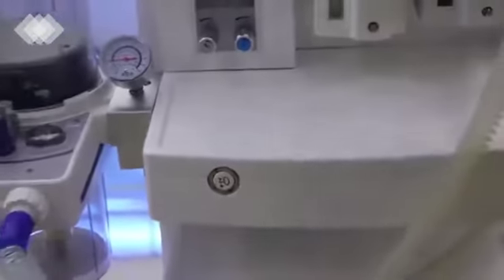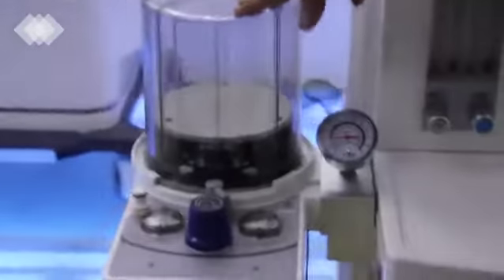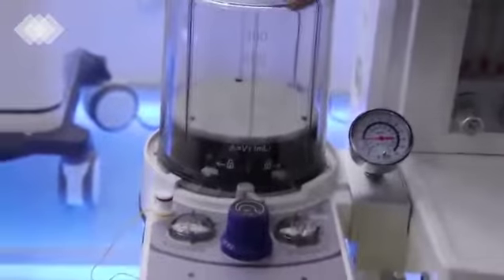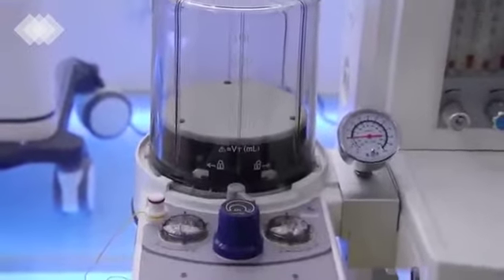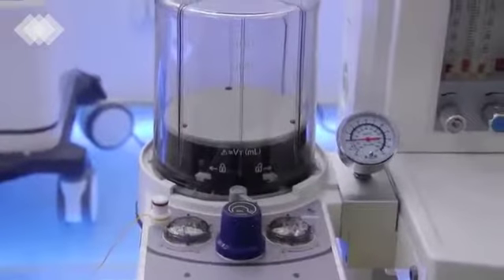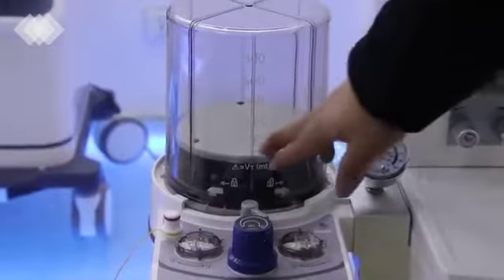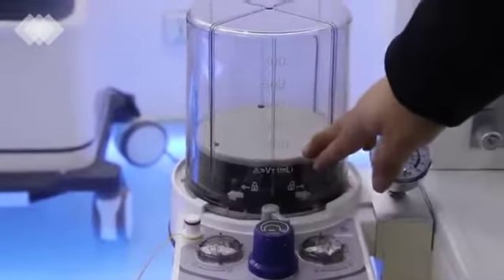And here for the rapid oxygen supply, this button is usually used in some emergency situations, or after the patient use. We need to recover the patient soon, then we will use this button. And now let's see the patient circuit. Here for this bellows, as I mentioned, our machine can be used from neonatal, about 2 kg, to adult. So this bellows, you can see, is also from 20 to 1,500 milliliters.